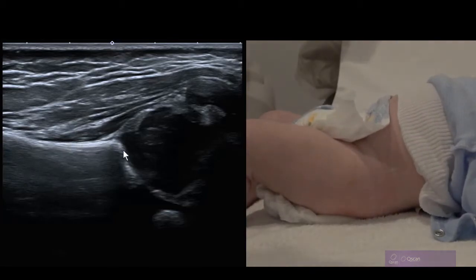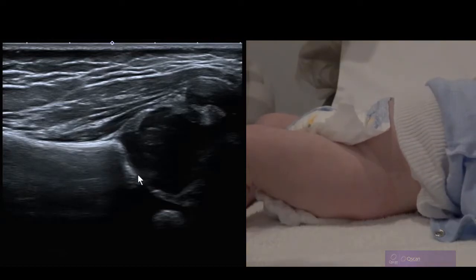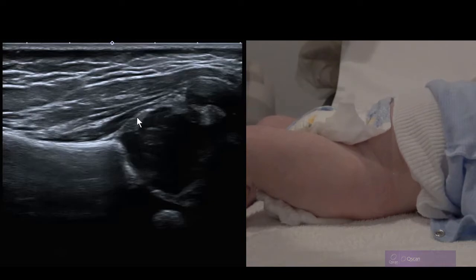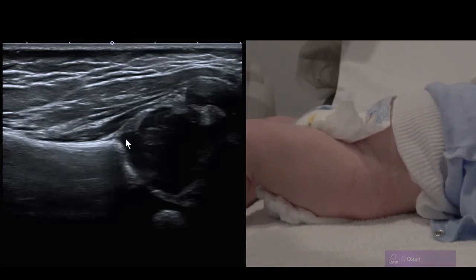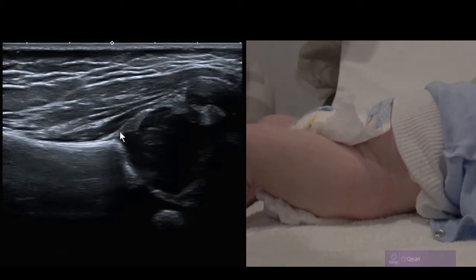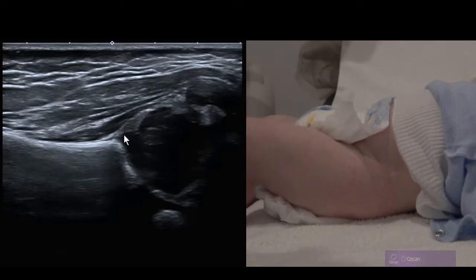The bony rim is where we see convexity transition to concavity. That hypoechoic structure is triradiate cartilage. This echogenic triangle is the labrum. This is the cartilaginous roof which, along with the joint capsule, helps to stabilise the femoral head within the socket more laterally.